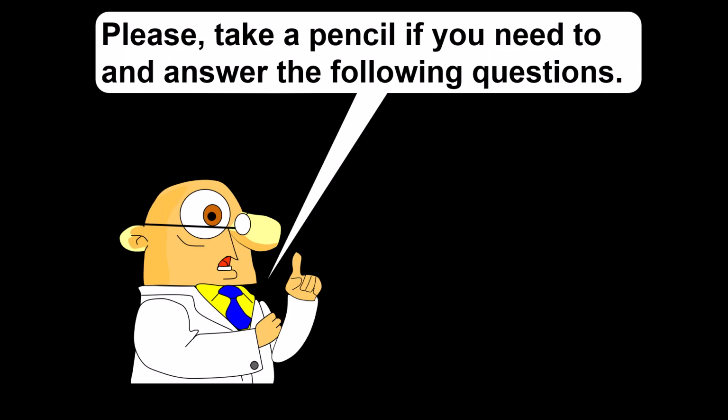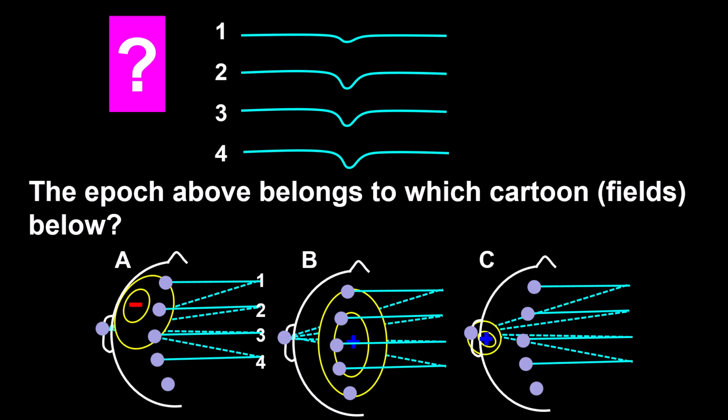Please take your time to answer the following questions. If you get them right, it means that you understand common electrode reference montage. I suggest you take a pencil and try to answer them on paper before you choose an answer. The epoch above belongs to which cartoon below?